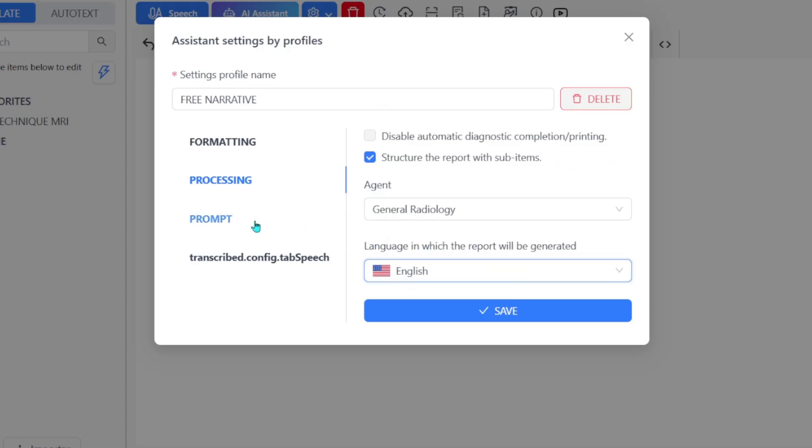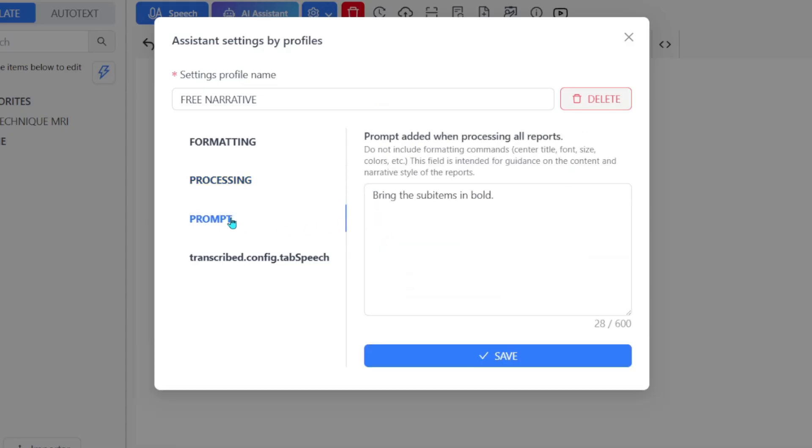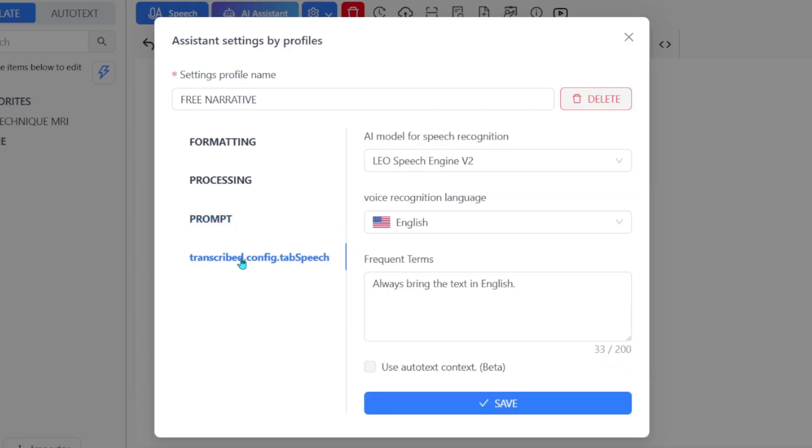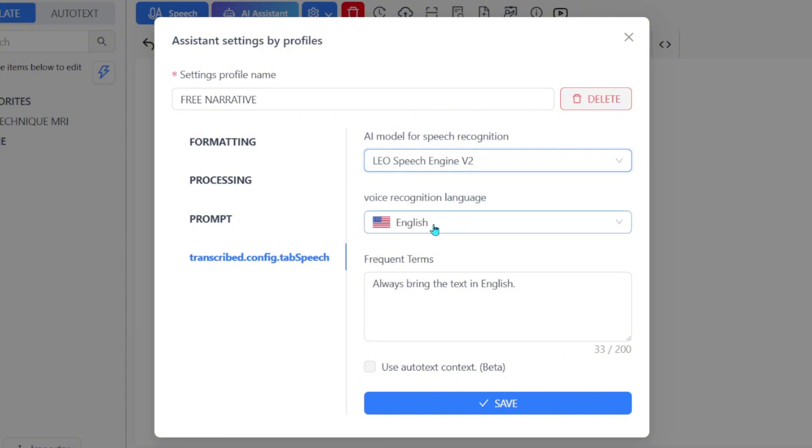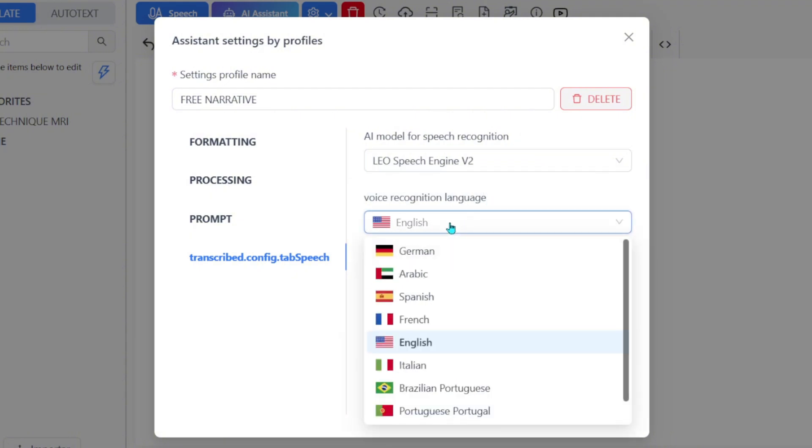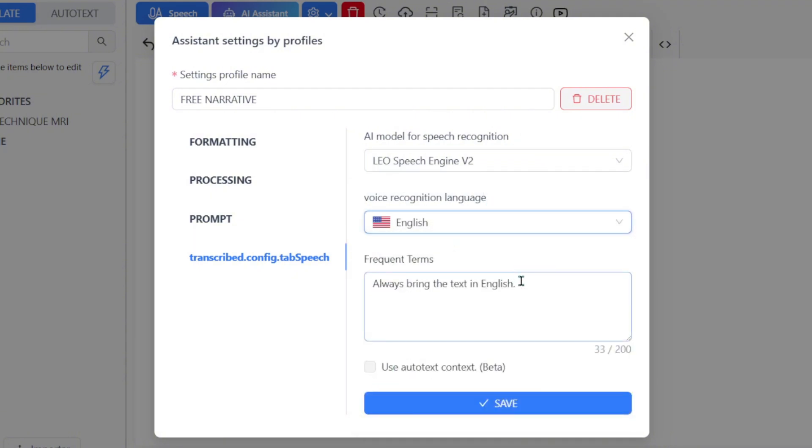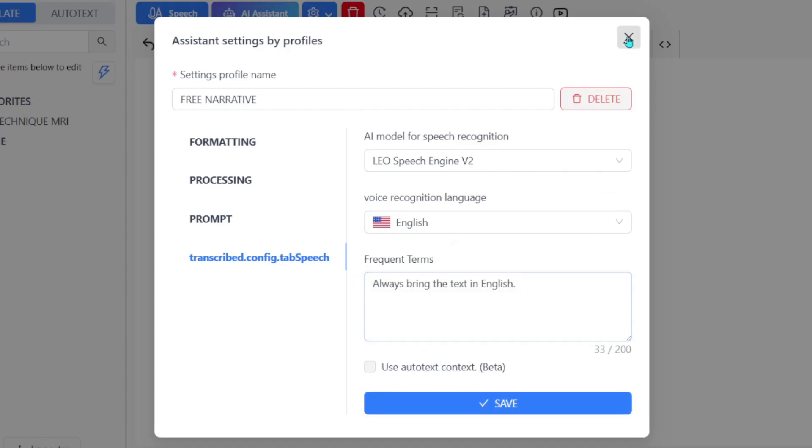In the Prompt tab, you can customize how the assistant will transcribe your text. In the Speech AI tab, we recommend selecting the Leo Speech Engine V2 model. You should also select the voice recognition language and reinforce the prompt with the desired language. Click Add and you're all set.